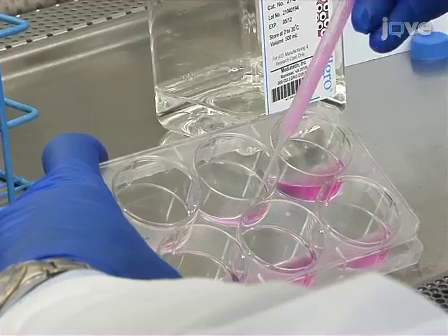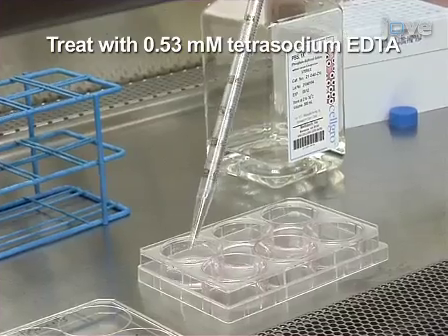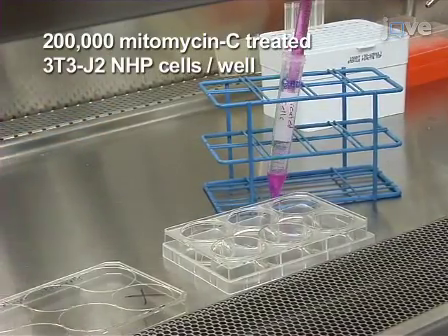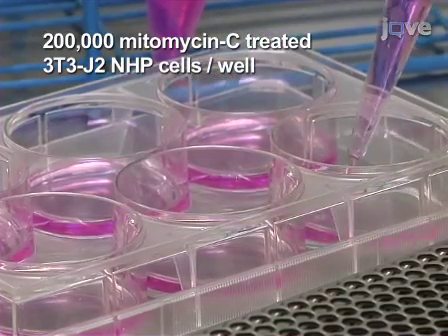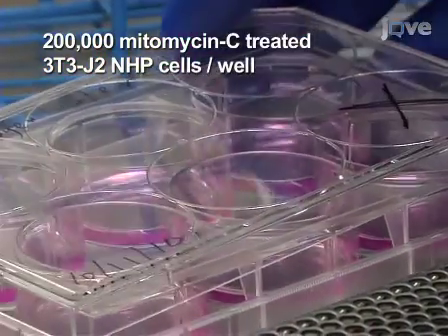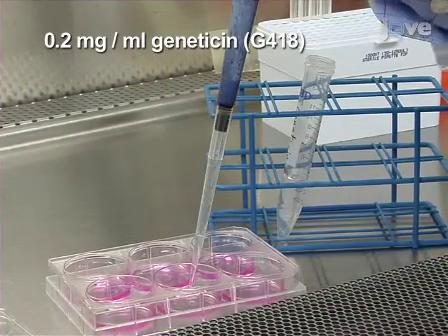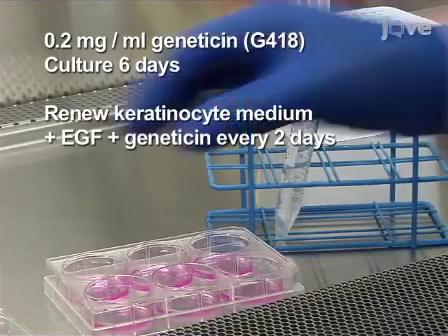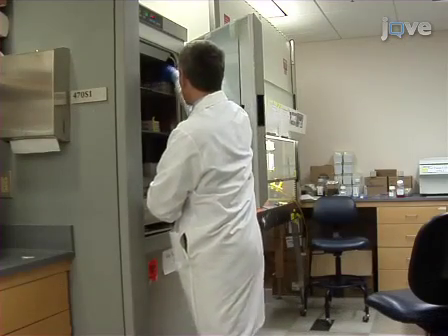After six days, remove the feeder and PA317 cells by treating with 0.53 millimolar tetrasodium EDTA as before. Then add 200,000 mitomycin C-treated 3T3-J2 NHP cells per well. The 3T3-J2 NHP cells are feeder cells that are neomycin, hygromycin, and puromycin resistant, which is required for the selection procedure. For selection, culture the cells under 0.2 milligrams per milliliter of geneticin or G418 for an additional six days, renewing fresh G418-containing keratinocyte medium plus EGF every two days. Surviving epithelial stem cells will be immortalized stem cells.